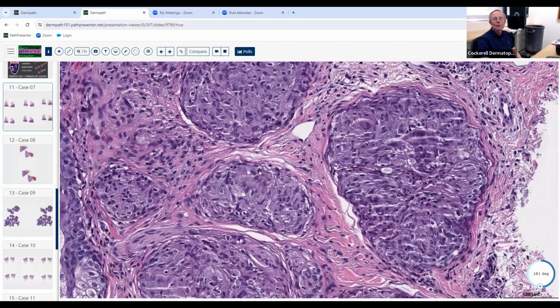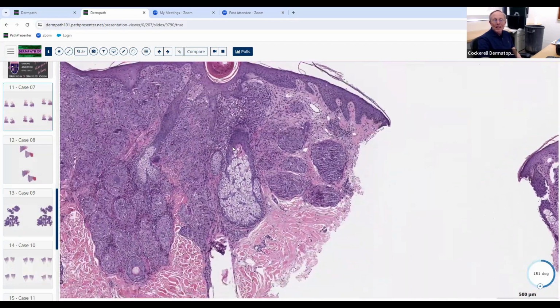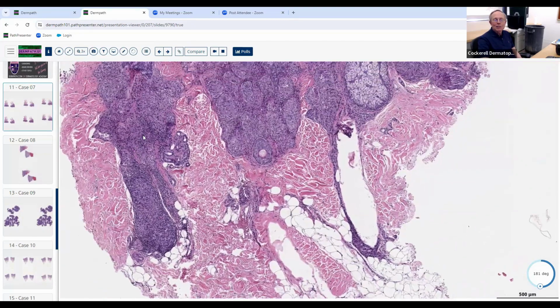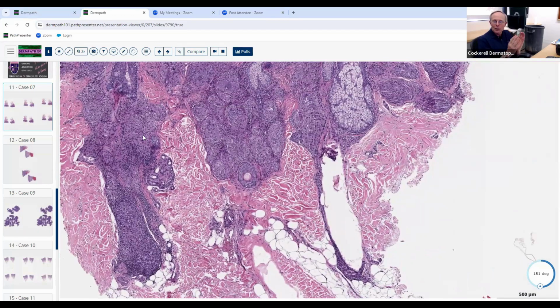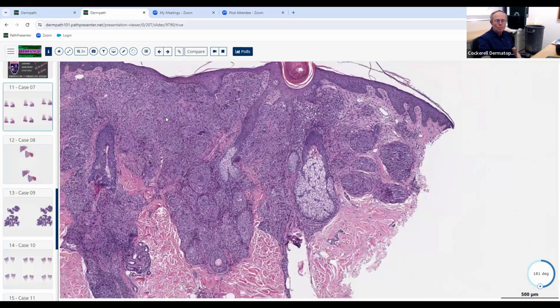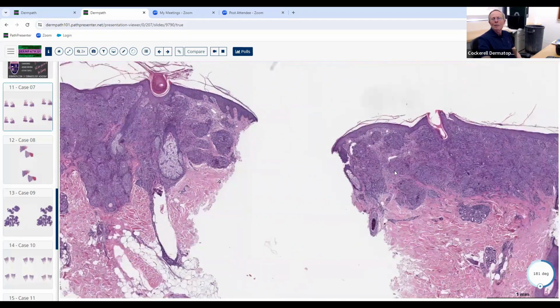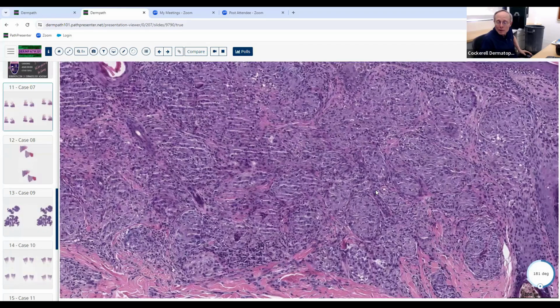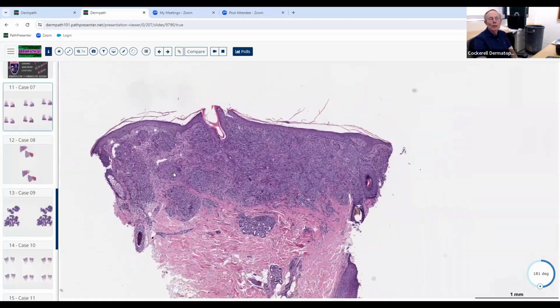They get these nice epithelioid granulomas. Now the differential, you can usually tell tuberculoid Hansen's from sarcoid itself because Hansen's is usually centered mostly around neurovascular bundles. It hits the nerves primarily, and you don't usually get this diffuse sarcoidal pattern like you see here. So this is a classic example of sarcoid. And you never know, they might ask you this and expect you to recognize it and pick it out of a lineup of choices. But you should be able to recognize this as a classic example of sarcoidal granulomatous dermatitis. Beautiful example of it.